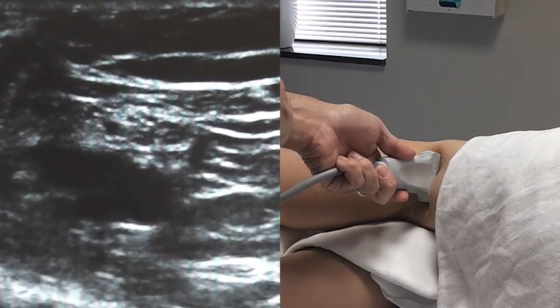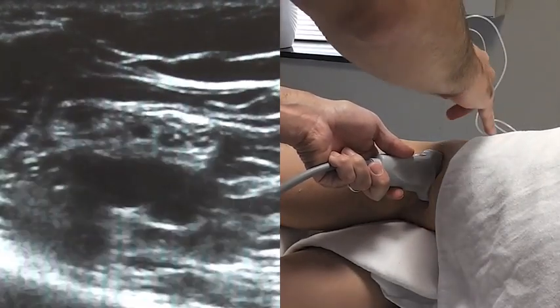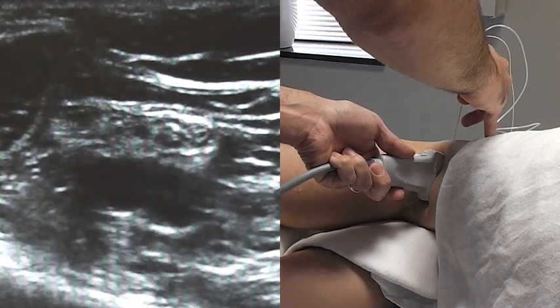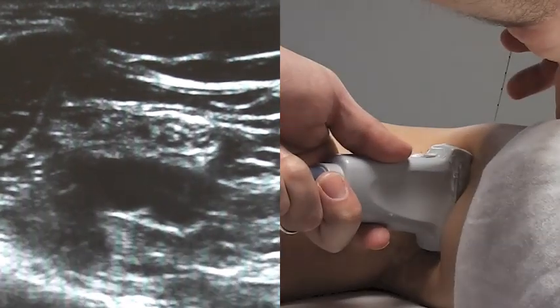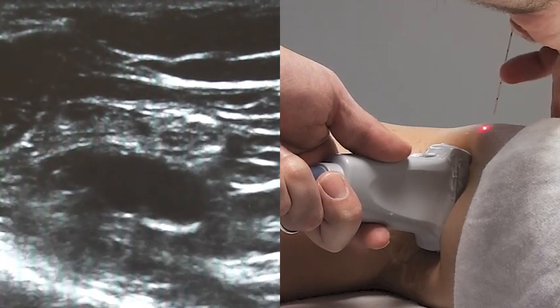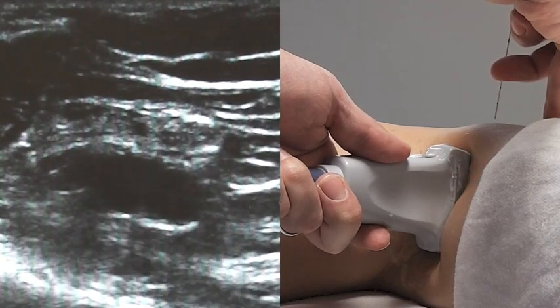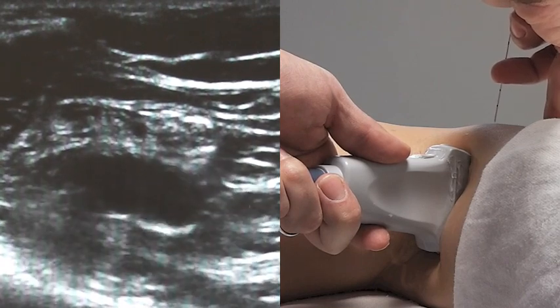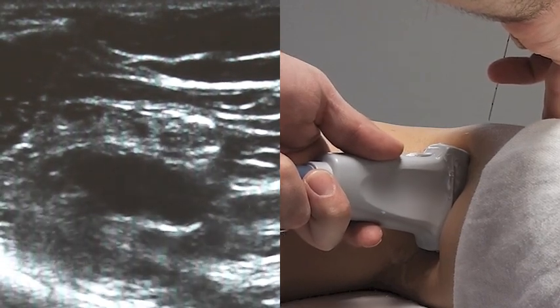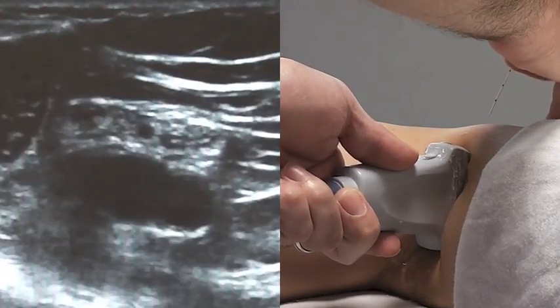So I'm going to keep my probe exactly where it is so I have a nice view with the nerve sitting right in mid-screen. When I do the block, I'm going to line the needle up perfectly with the probe and go down approximately 1.75 cm. From there, you'll see on screen that we make slight adjustments as we head toward the nerve. It's very important to try to keep the needle lined up with the probe, or you're going to lose the needle view — or think you're seeing the end of the needle when in reality the end is distal to what you're seeing. Try to keep the needle in line, and only move one thing at a time. If you start moving the ultrasound probe and the needle simultaneously, very slight movements can lead to a very difficult time on screen.